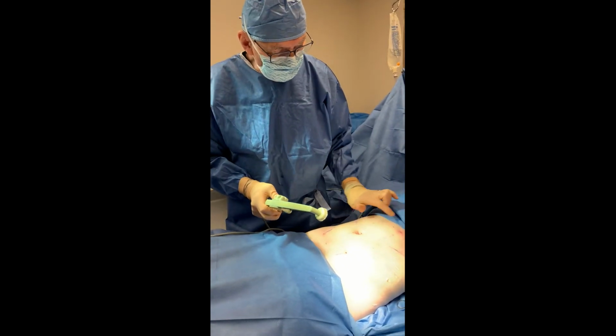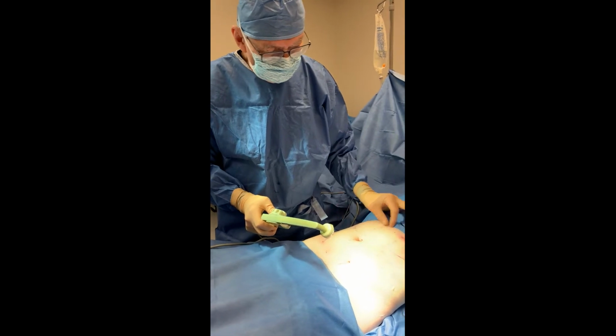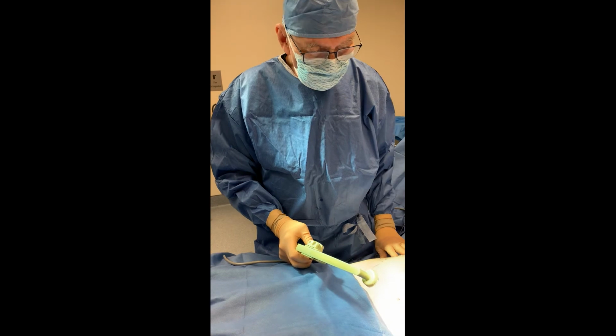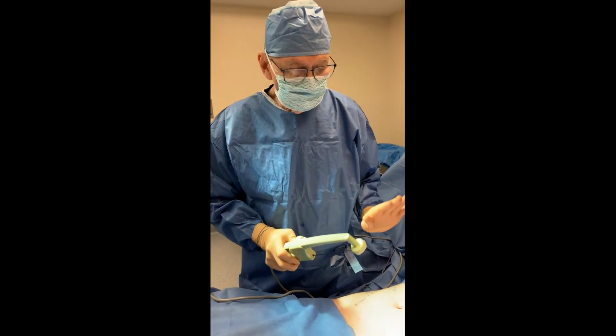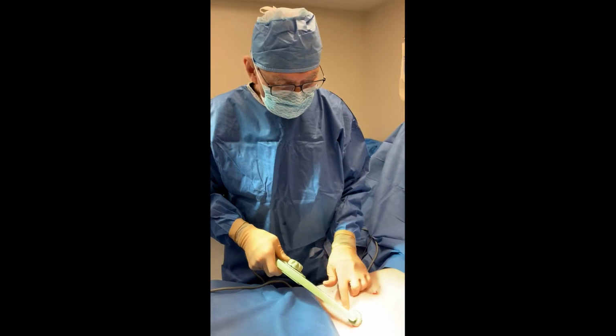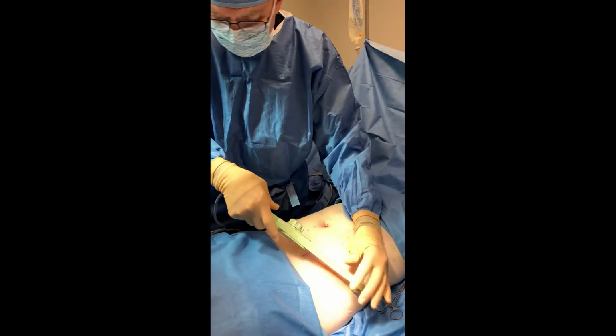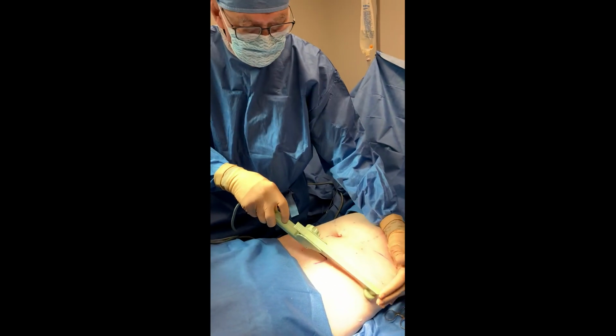At the end of this, what we're going to do is come in the midline, define the mid portion of the abdomen, and then do the same thing on the other side of the abdomen. So we're going to start now and begin this.